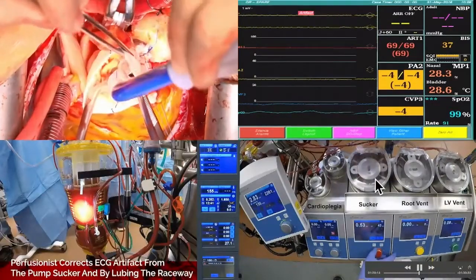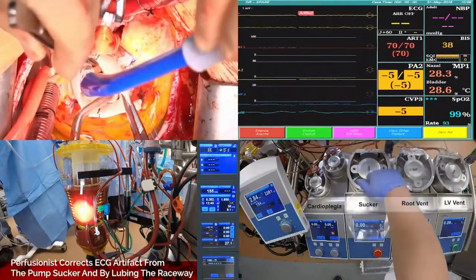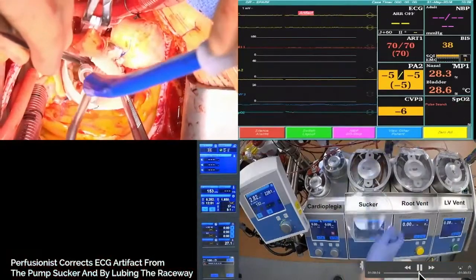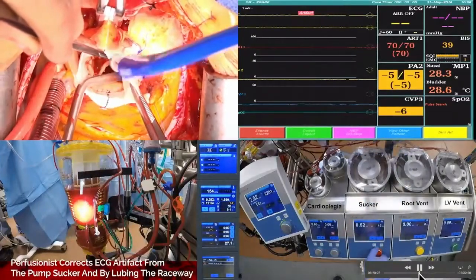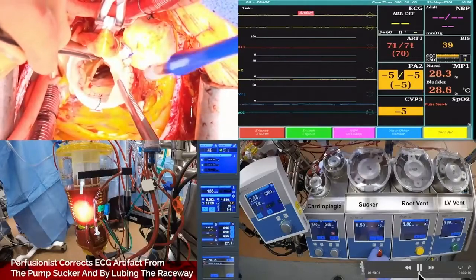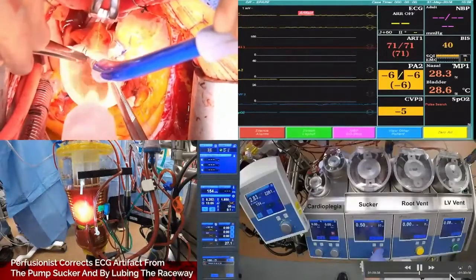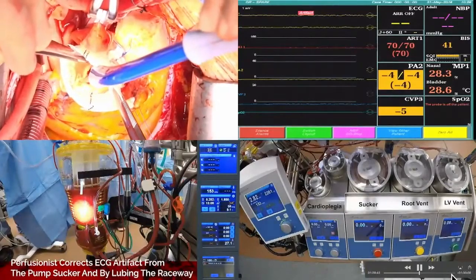You know what he's doing, dude? I'll tell you what's funny about this. Did you see it? Did you see what happened? Go back just about 5 seconds. That's okay. Just let it run. Don't go back. Just keep an eye on the pump head. It jams. Yeah, the tubing starts creeping through there.